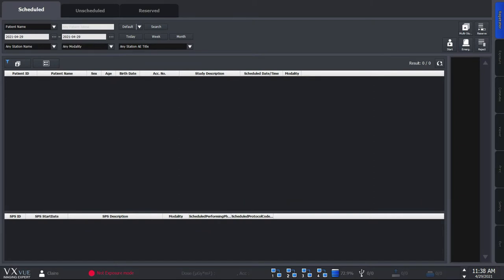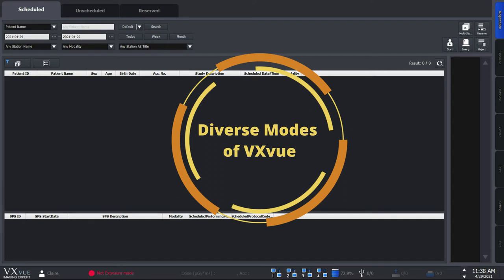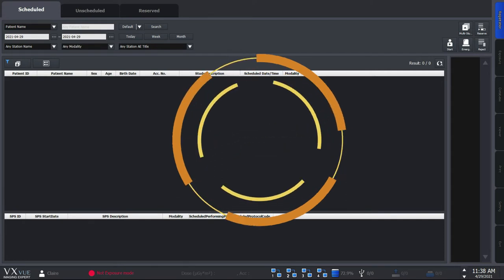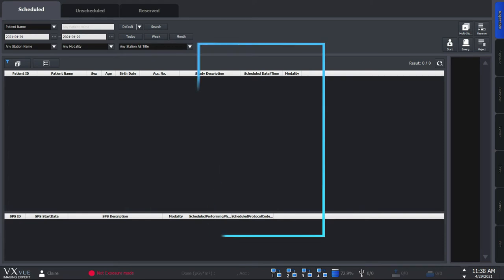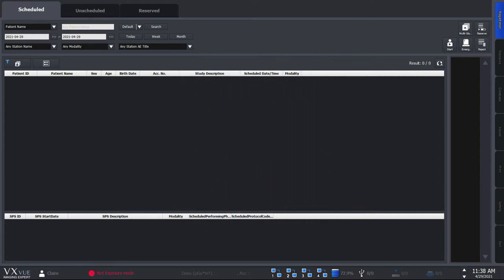Welcome back to VueWorks VXVue Quick Guide. Today's video will be on introducing different modes other than for human application. VXVue supports different modes and functions to respond to diverse user needs depending on your application, such as veterinary or vehicle application. Kiosk and touch modes are available for all applications or VXVue modes. VXVue supports a total of 9 languages and you can customize the language if necessary.